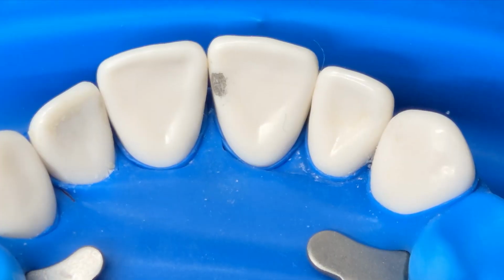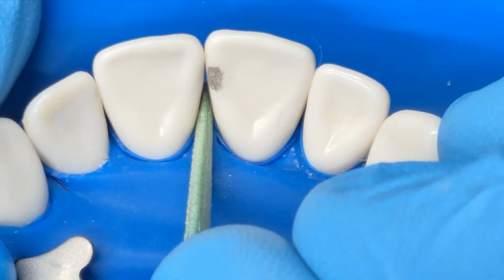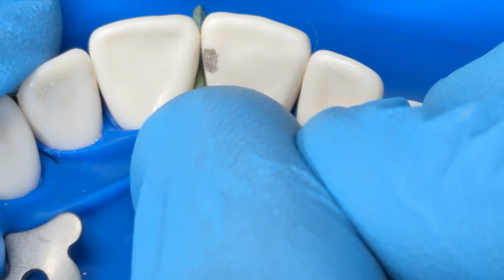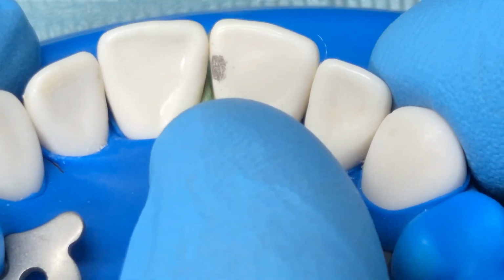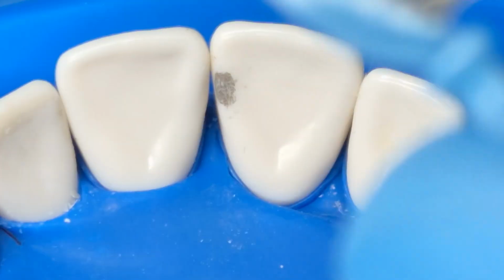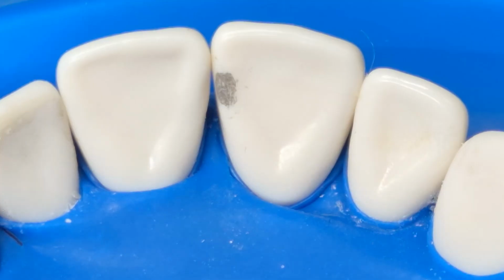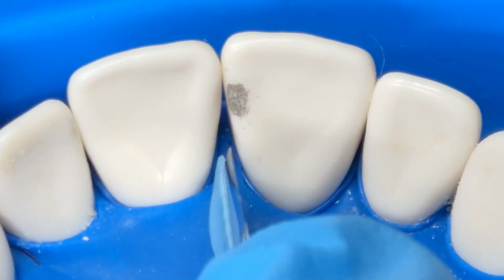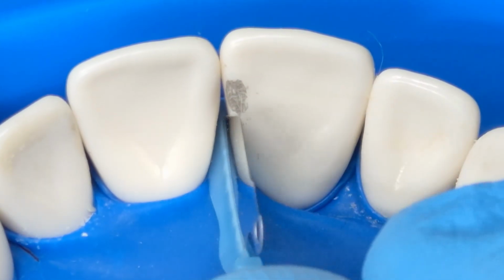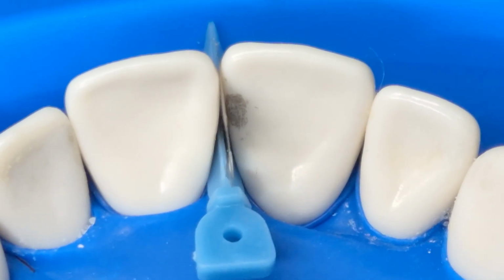Before starting the prep, the adjacent tooth must be protected. One method is to place a wedge to provide some separation and therefore reduce the likelihood of adjacent tooth injury. We're using products like a wedge guard that has a metal piece as an additional protection. In both cases, these techniques are not a guarantee to protect the adjacent tooth, so please keep that in mind.